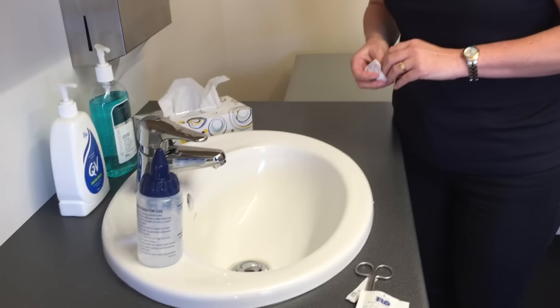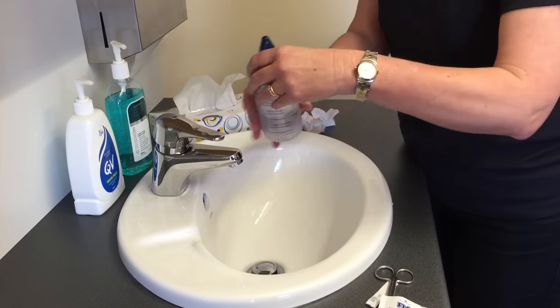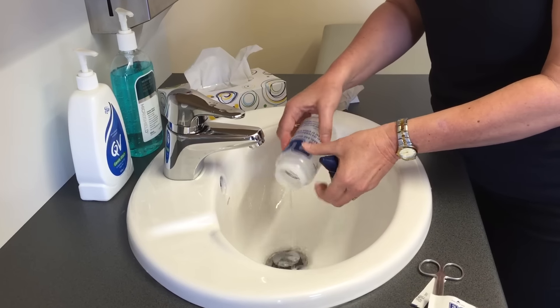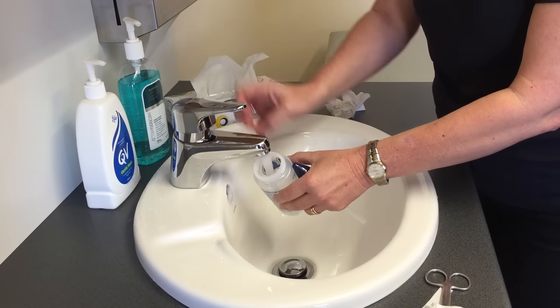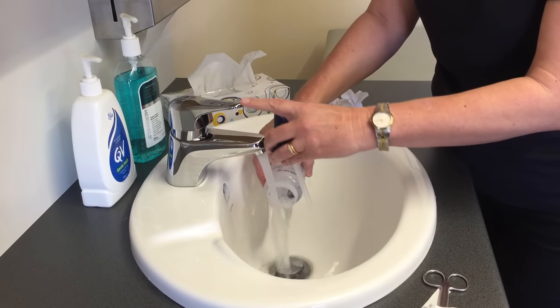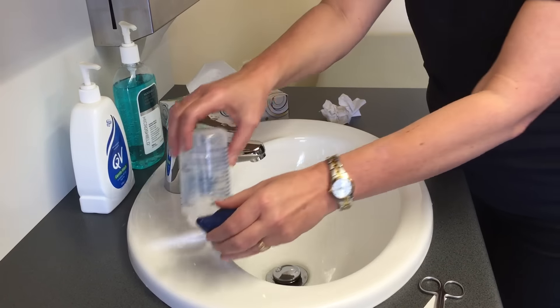Then take the lid off the bottle and rinse it thoroughly, and allow it to dry completely between uses. Every few days it's important to wash the bottle in hot soapy water with a bottle brush, or use a cleaning solution that you can purchase from the pharmacy.